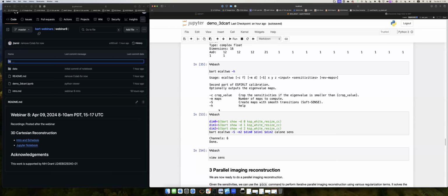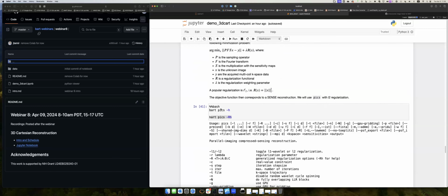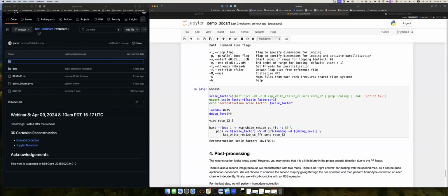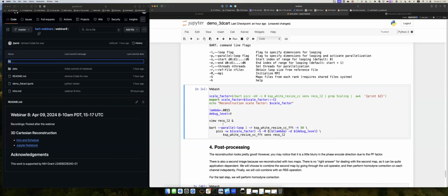But I mean, then your K-space is wrong because you don't have the roll-off correction, right? Or how do I have to think about that? I mean, you have the roll-off correction always in image space, so you need the FFT and then go back. Yeah, don't know.